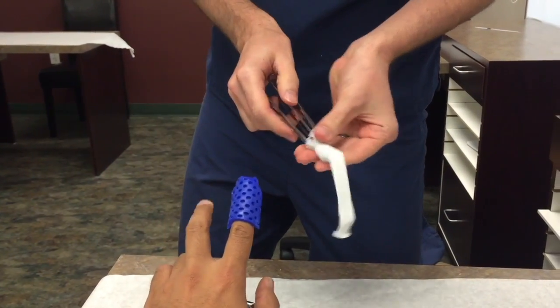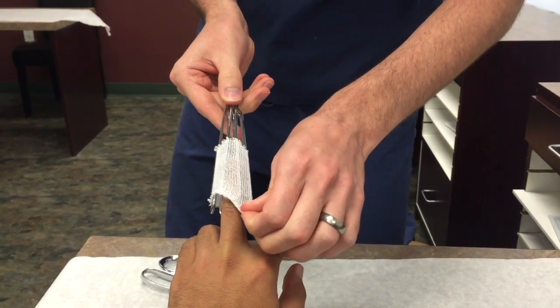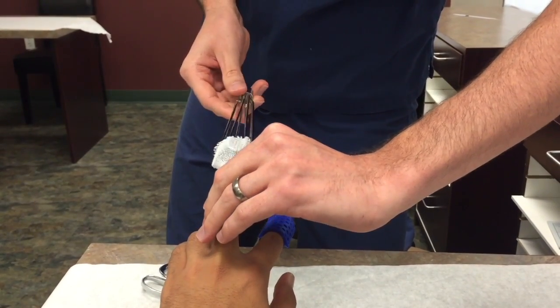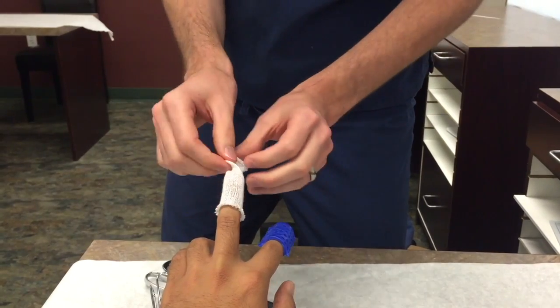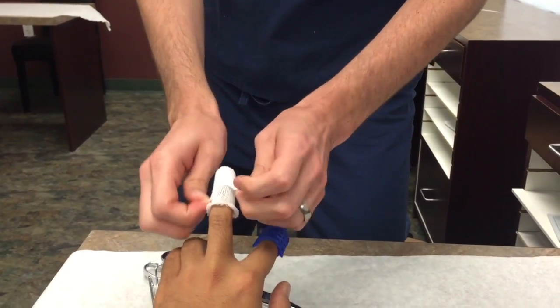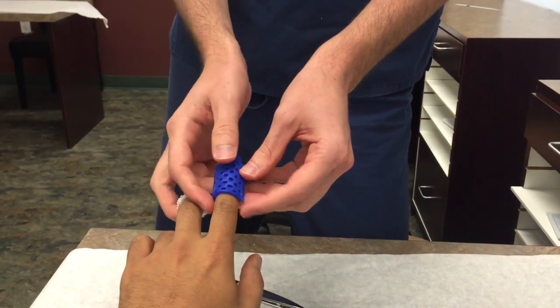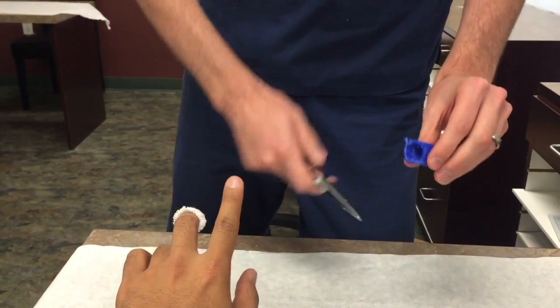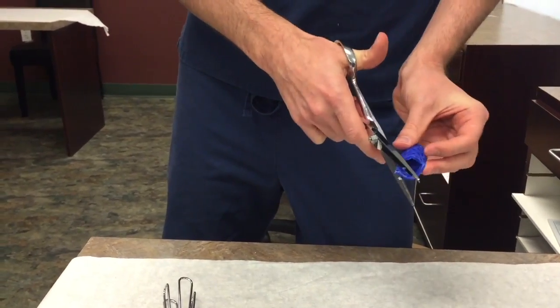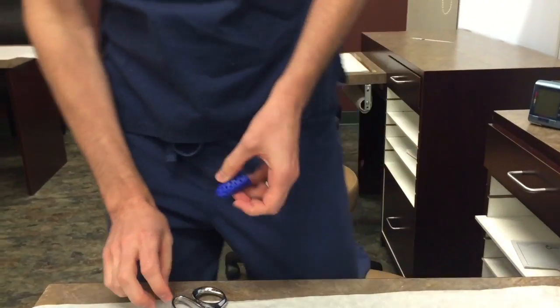We'll just do it on a different finger. Like if their finger is really injured or there's blood everywhere, I'll just put this on — say at that bar — and you can twist it right here. If I didn't do it long enough, you can just put it right back on and go longer if you need to. Then just make sure it slides on and off pretty well, cut the edges so they're nice and smooth, and that's basically it. If they need any modifications, you can do that.